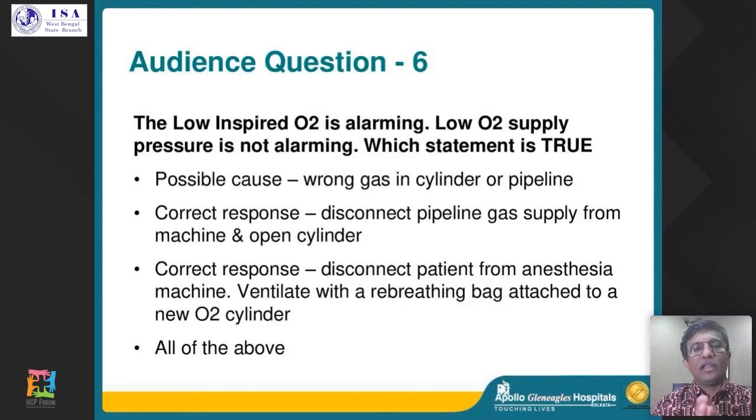Okay, now you have a low inspired oxygen alarm that is alarming. The low oxygen supply pressure is not alarming. So the scenario is that the low inspired oxygen concentration is alarming. The oxygen supply pressure is not alarming. In this scenario, which of the statements is true?